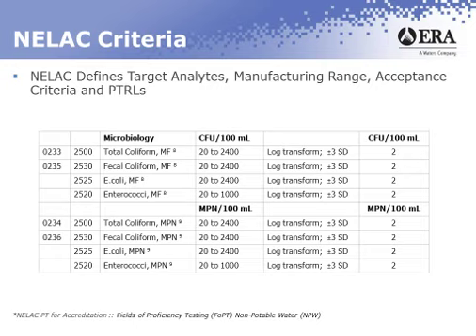When I say that, what I mean is that we must collect the data separately and evaluate them independently from each other. The primary reason that they split these analytes apart was because different methods produce different results with different standard deviations. So in order to treat everyone fairly, they're split apart. Everyone isn't lumped together. So currently, those are the 8 analytes that are defined, and we need to treat all of those independently.